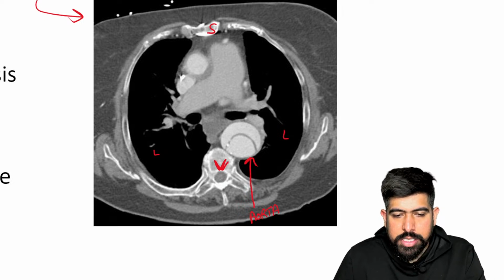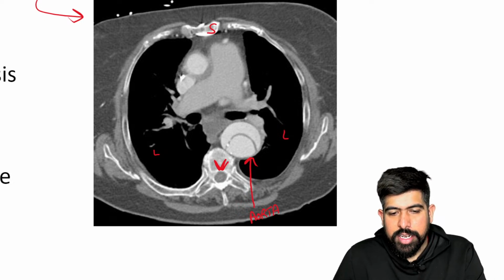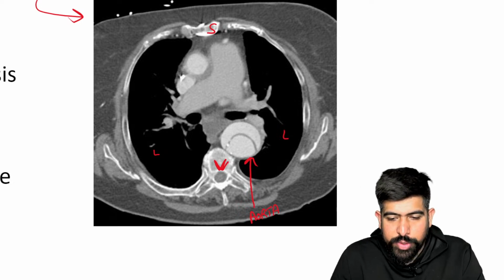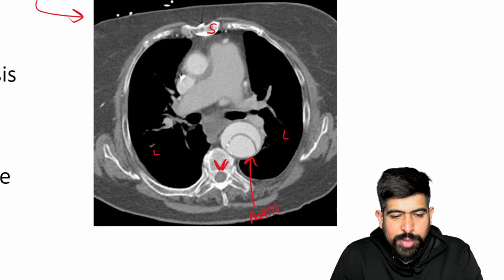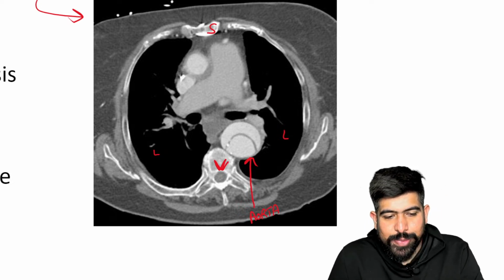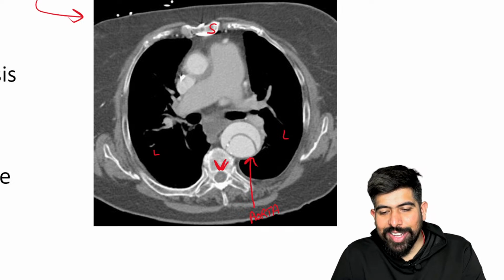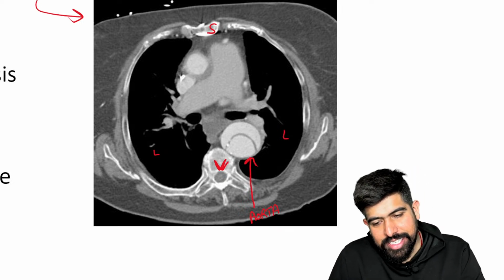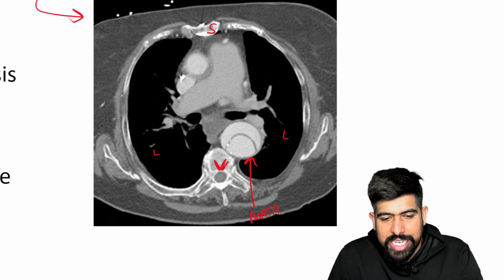Now something is seen to you. I think I gave you a clear hint. I think now you can reply. Yes, very good. You made the diagnosis, guys. This is aortic dissection. Very good. Now tell me, which sign is it?